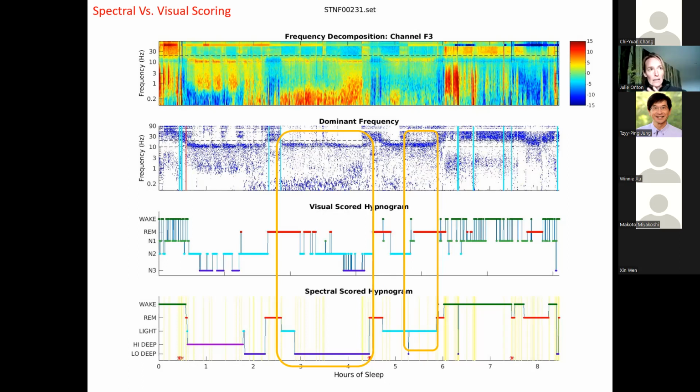So he's, I think, well habituated to sleeping only, I think it was like 4 hours. And he actually went up and down into everything. Subjectively, he had the worst sleep I've almost ever encountered, but his cycles actually looked far more normal than other people. So we'll check out Ziping, see how it looks in a well habituated 4-hour sleeper.